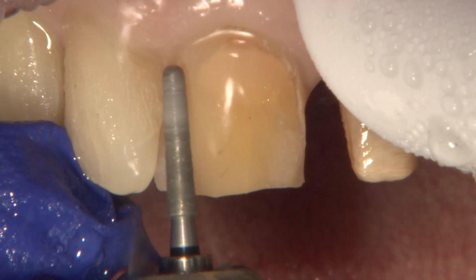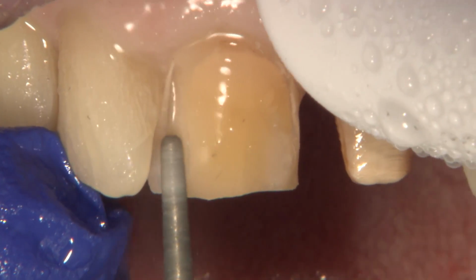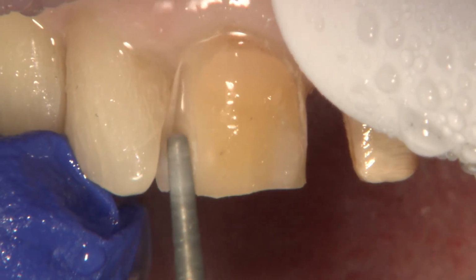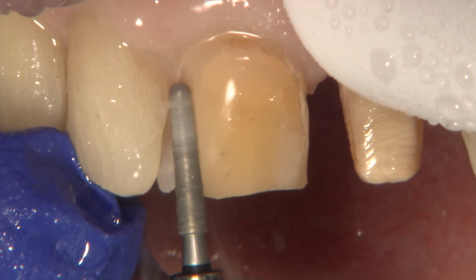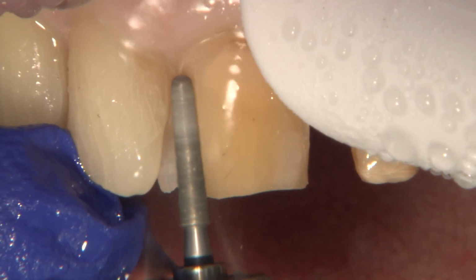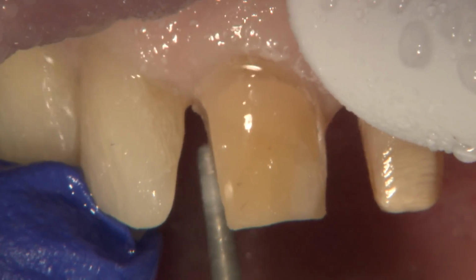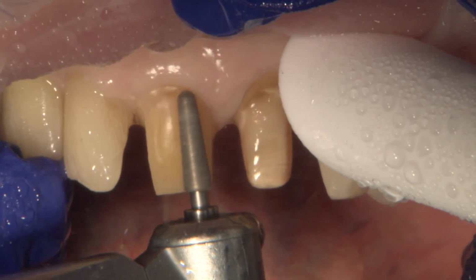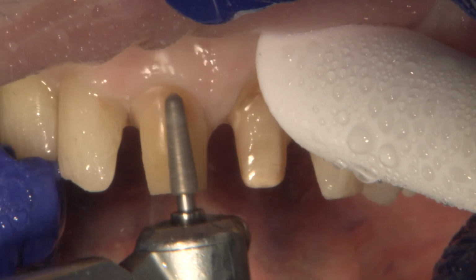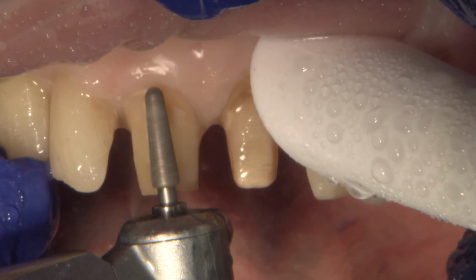For number 8, I aim to prepare it similarly to number 9. I used the same round-ended tapered diamond for all of the initial axial reduction. I like to prep the more difficult interproximal areas first and then blend into the facial and lingual surfaces. Since the tooth has a slight lingual inclination, I'm primarily reducing more along the cervical third on the facial to provide the recommended 1 millimeter reduction along these aspects.